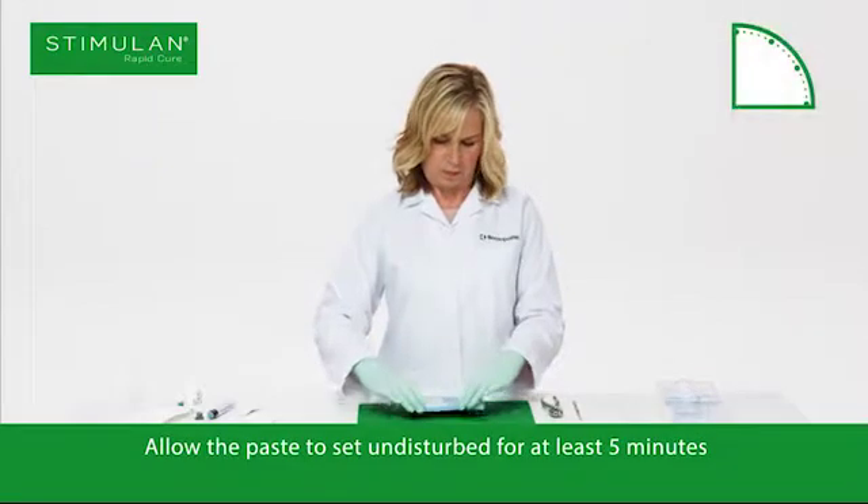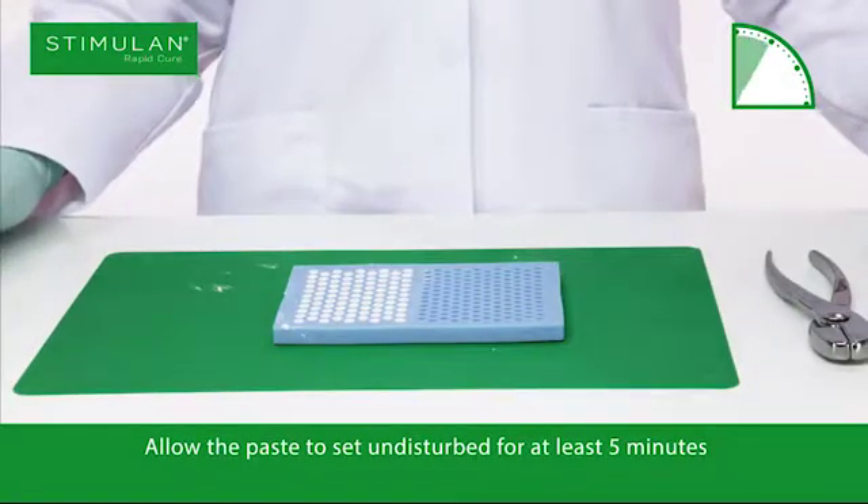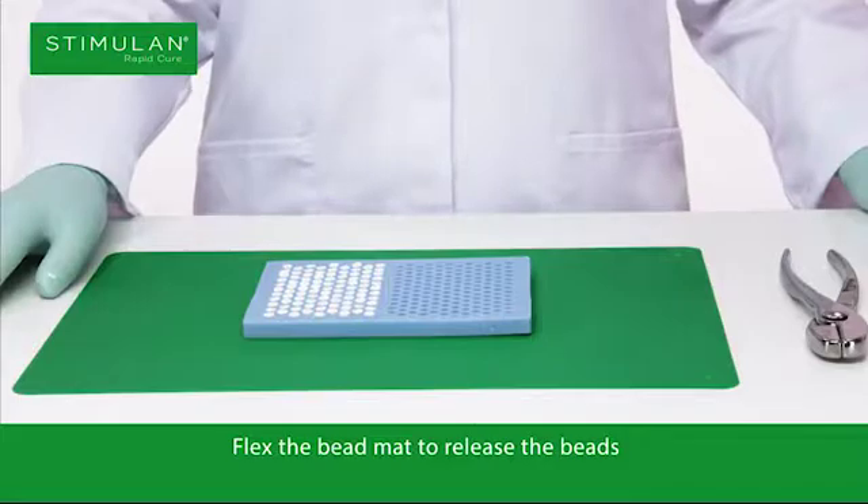Firmly tap the mat on a hard surface to release any air trapped in the bead cavities. Allow the paste to set undisturbed for at least 5 minutes. Flex the bead mat to release the beads.